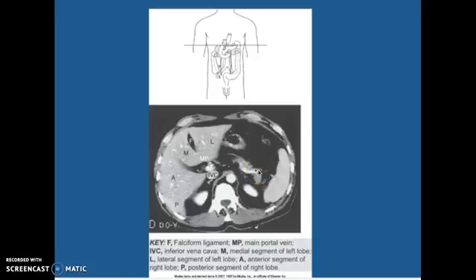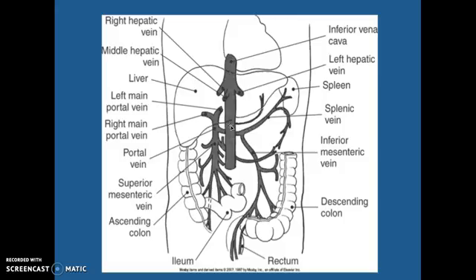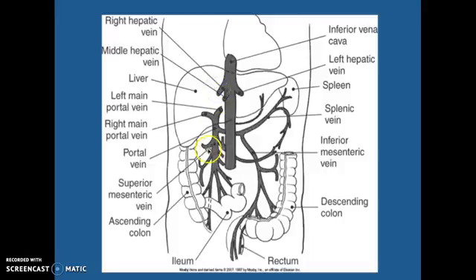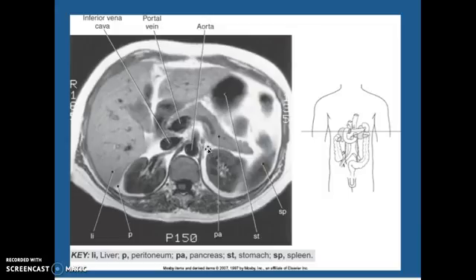This is a CT angio. Here's your left kidney, your right kidney, inferior vena cava, here's your aorta, and your main portal vein right by your IVC. Coming up — because it's the venous system — this is your inferior vena cava. We have your left hepatic vein, your middle hepatic vein, and your right hepatic vein.